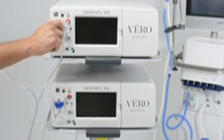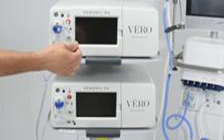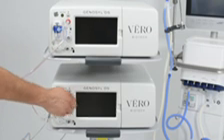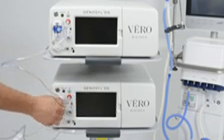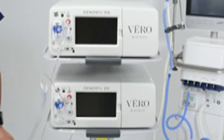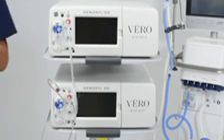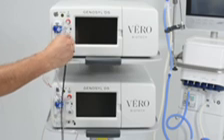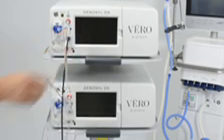Push and twist clockwise the short Y end of the blue sample line to the gas sample port on the front of the water trap, attached to the top console. Repeat connections for the red NO injection line and the blue sample line on the bottom console. Connect the adaptive sensor cable to the adaptive sensor port on the console that will be used to dose Genasil.